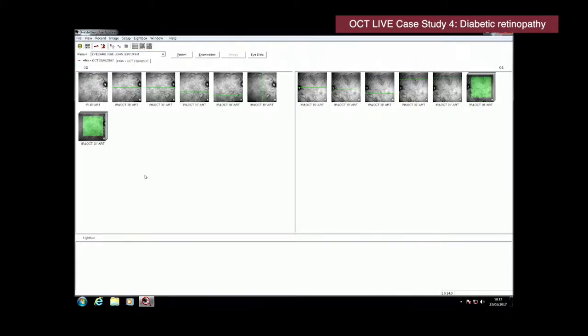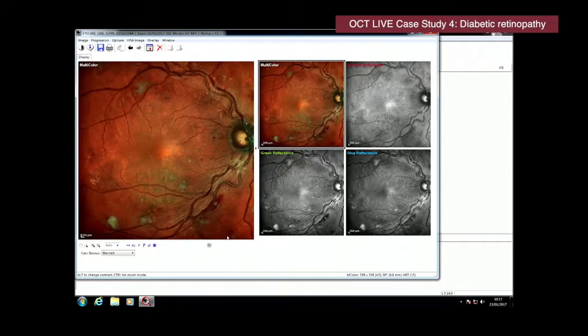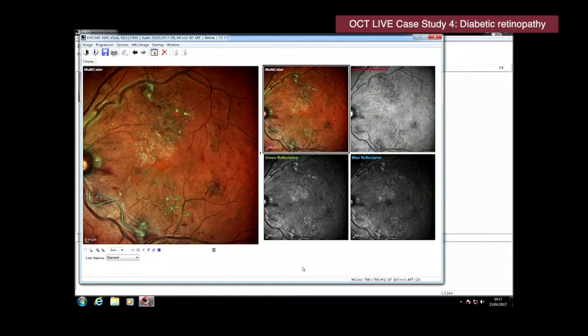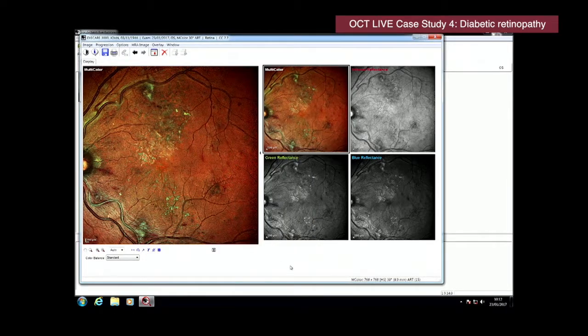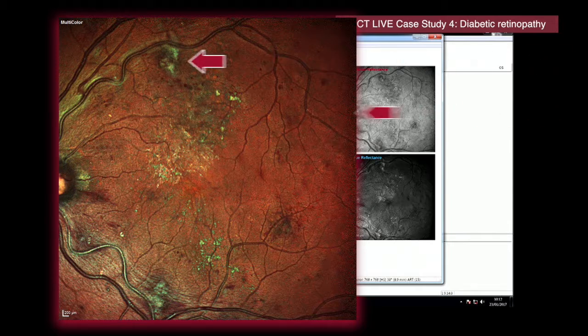Okay, Phil, could we just quickly look at the previous scans that we acquired, if we just pull up the colour picture of the other eye, actually, please. Sorry, Phil. Okay. So again, this is a colour picture that we acquired just before the start of this session. Okay, and again, we can see an awful lot of important changes simply within the fundus image. Lots of highly reflective material, which is very likely to be exudate. We've got these areas here, which is all areas where we can see leakage.